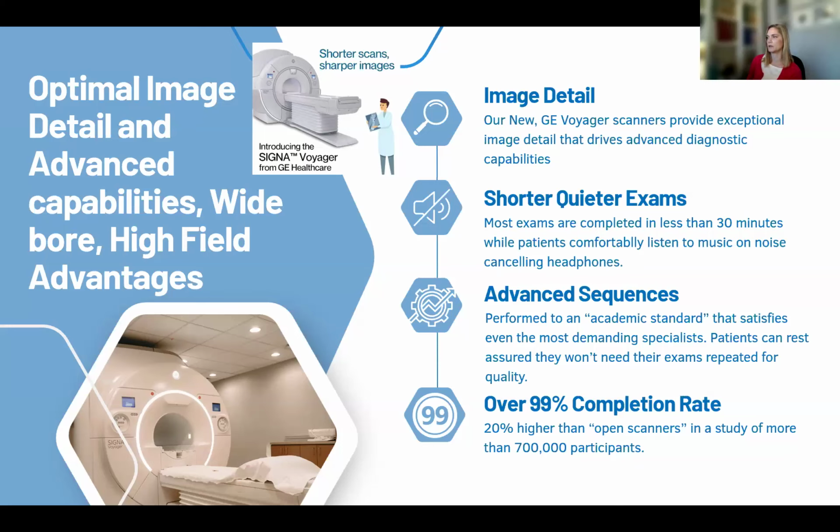Patients listen to music on noise canceling headphones to help reduce that noise. All of our sequences are done at an academic level standard that satisfies even the most demanding specialists and surgeons. And we have over a 99% completion rate, with less than 1% of scans ever needing to be redone. That is over a 20% higher completion rate than in open scanners, in a study of over 700,000 patients.